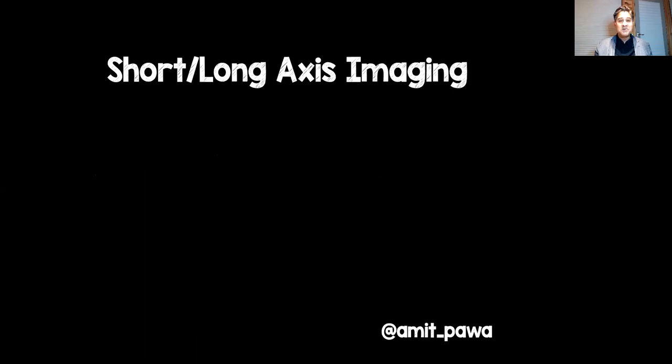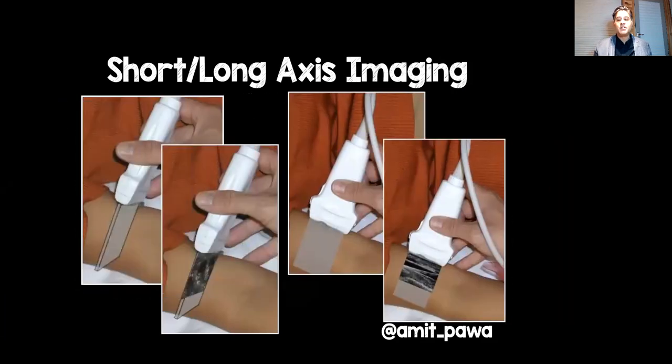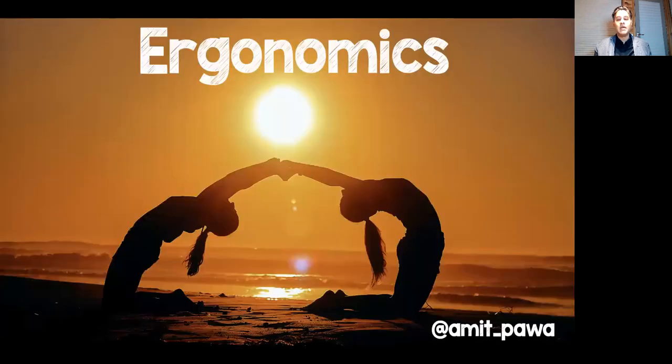Again, some really old images here, but this is a short axis view of the median nerve in the forearm. You can see the nerve as a cross section there. And then if we rotate the probe through 90 degrees, you get a long axis view of the median nerve in the forearm. So you can see the nerve along its length. So broadly speaking, those are the two types of images that you may get.